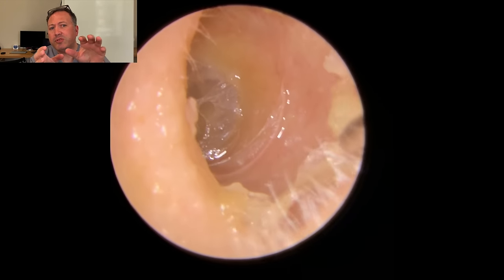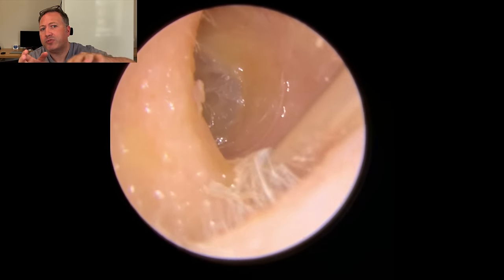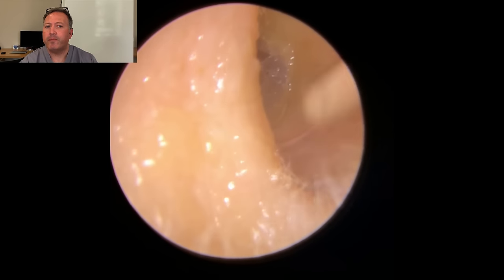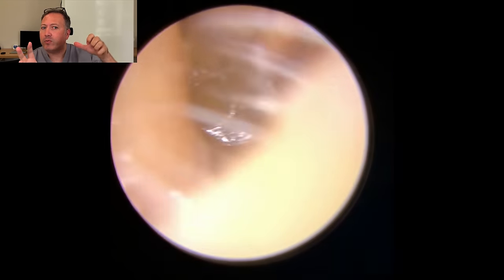One thing you'll notice, can you see there's a bit of a sheen to the skin? If you look to the right-hand side, you'll see almost like a little lip that's come up of this spiderwebby skin as well. And there's a sheen all the way along the outside, which would indicate to me that this spiderwebby skin is coming quite a way down the canal.